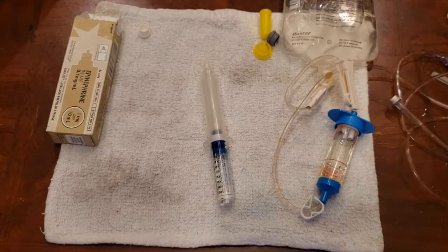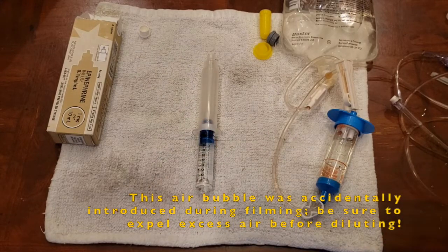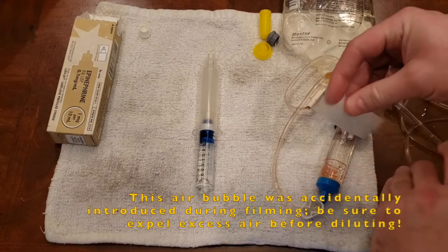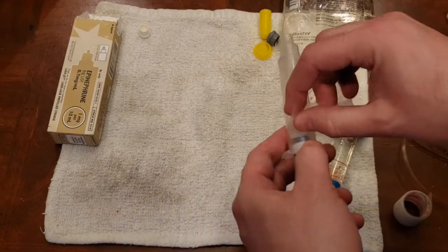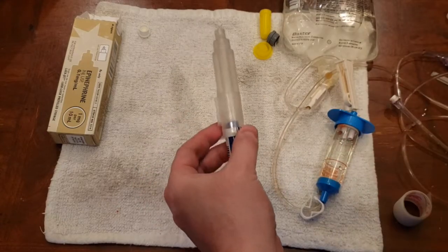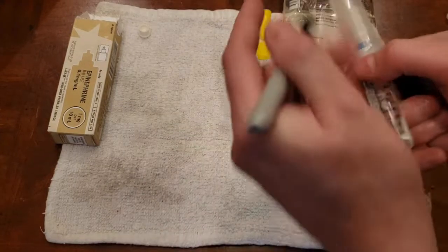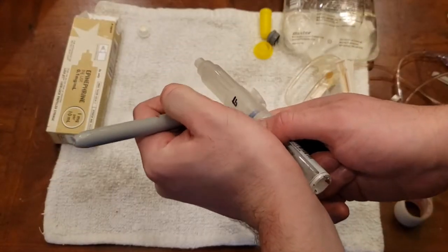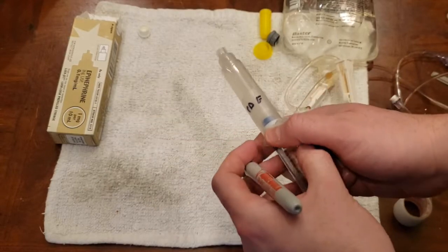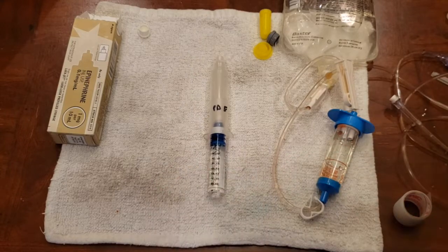Since we're talking about safety, a better practice would be to mark this diluted epinephrine preload with a piece of tape to symbolize that it has push-dose epi in it, or to simply write an 'E', or 'PDE' for push-dose epi, or any other symbol that would indicate to you that this is different than another preload.